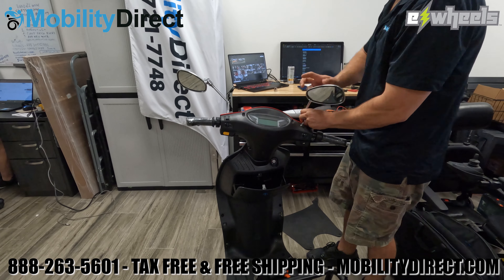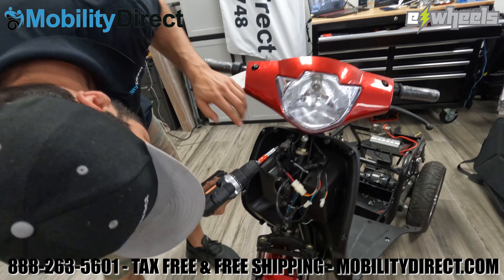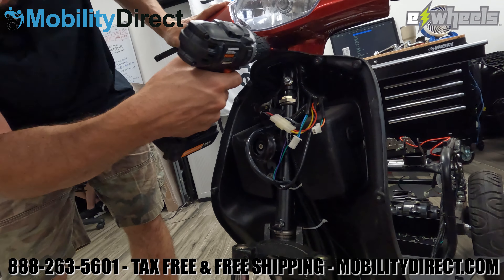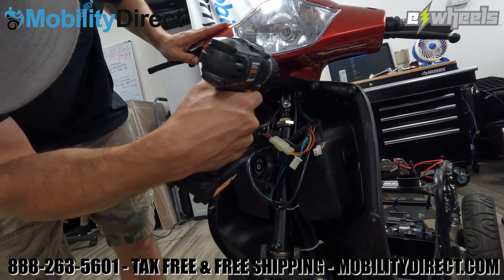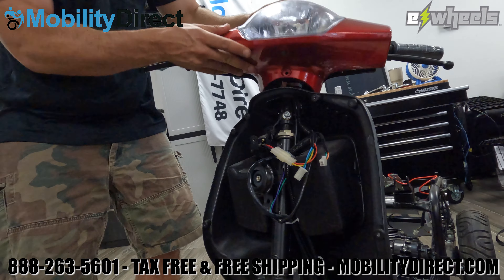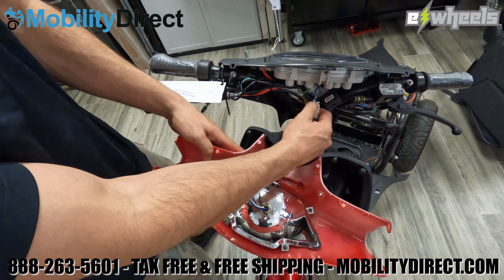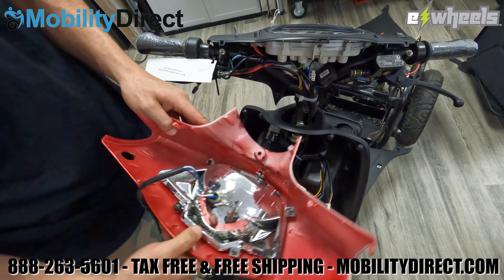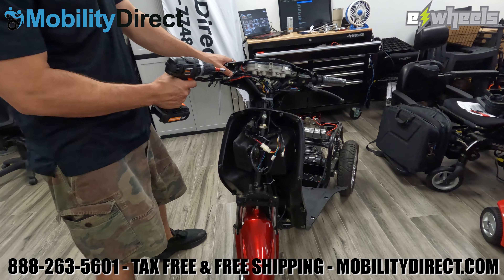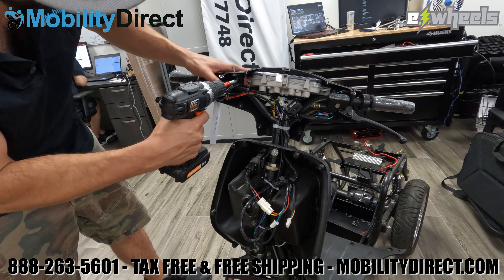Remove the mirrors one at a time — just twist them counterclockwise to get them out of the way. In the front of the scooter right underneath the front headlight, there is another large machine-style screw that you need to remove in order for the front panel to come out completely. There is a clip used for the headlight — in fact, all of the components use clips for the most part. If you pay attention to each component and where the wires come from, you can fish the wires back to the clip, so replacing parts is not too difficult.